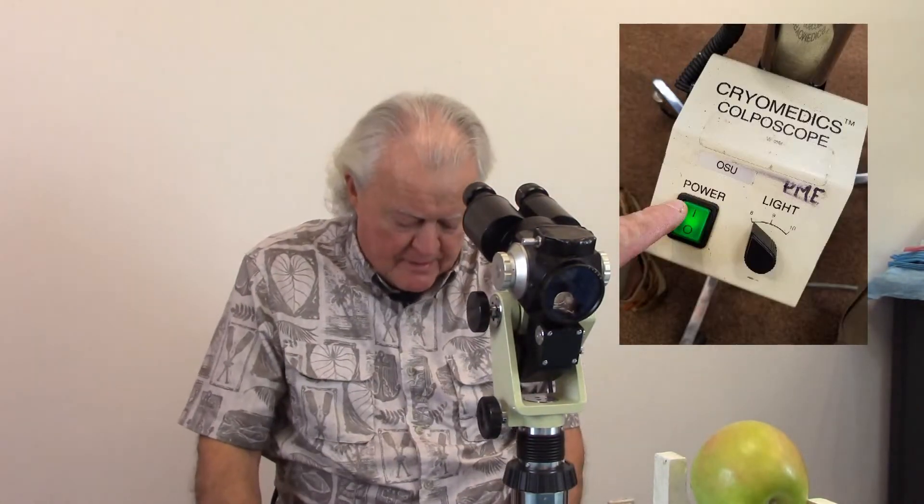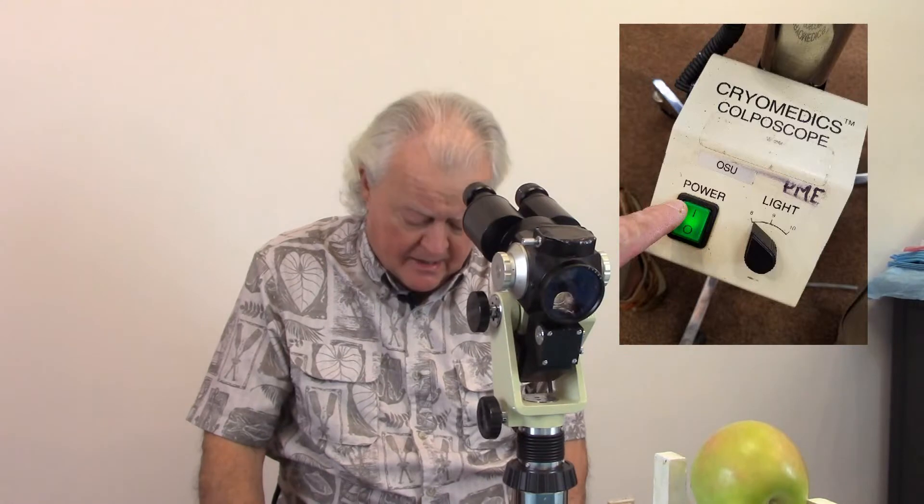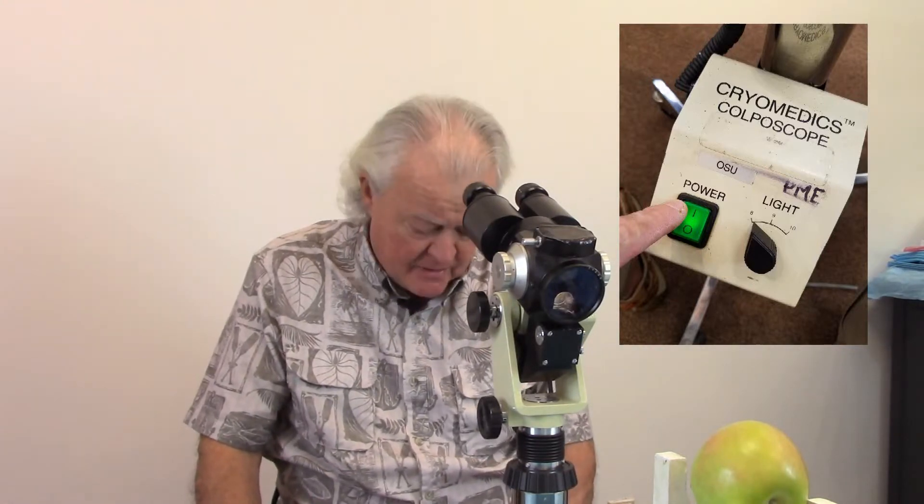First of all you've got to be comfortable with the scope, so you've got to adjust the height so you're not breaking your back. Of course if you have an adjustable patient bed, the patient can go up and down too. I have here a little apple in a holder as my target. The first thing to do is turn on the power for the light source — you can adjust the intensity on most of them. So I've got the right height and my light source is on.